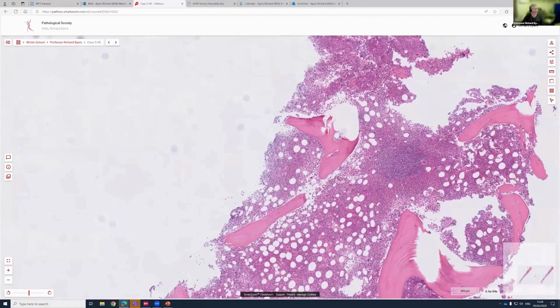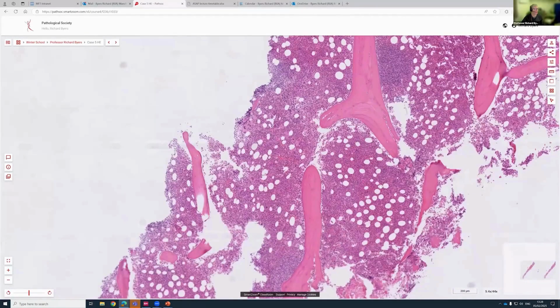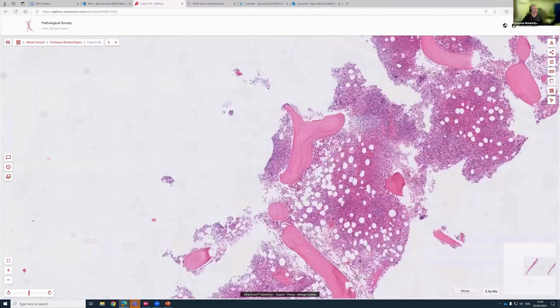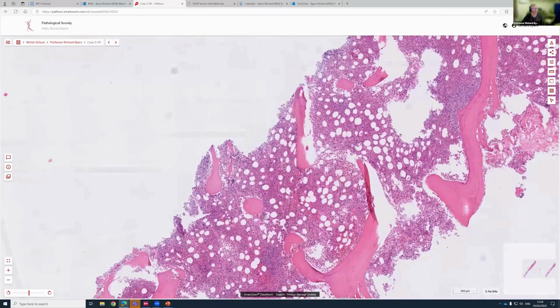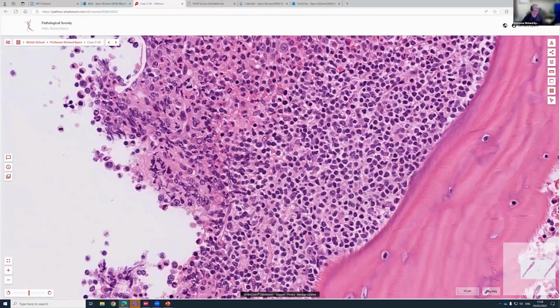It's also important to try and estimate what percentage of the trephine is involved. Now, this is going to be under 5%, I would say, certainly well under 10%. Because then when you treat the patient, you want to see the percentage go down. So looking into this area here, we do have some slightly elongated centrocyte-like cells. We have got some larger centroblast-like cells, but as I say, using morphology alone, it points to it, but it's not hard and fast.